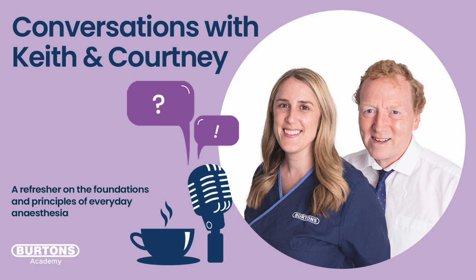So we're going to have to consider a number of things really: time for inspiration, pressure that we're allowed to achieve in inspiration, the volume that we're going to deliver during inspiration, and those three factors are some of the main factors we need to consider. Before we even get to that point, we need to have a little bit of understanding about some very basic physiology about the spontaneous breathing, because we're going to take over that spontaneous breathing. So we've either got to abolish it, or it has to be abolished by some mechanism.